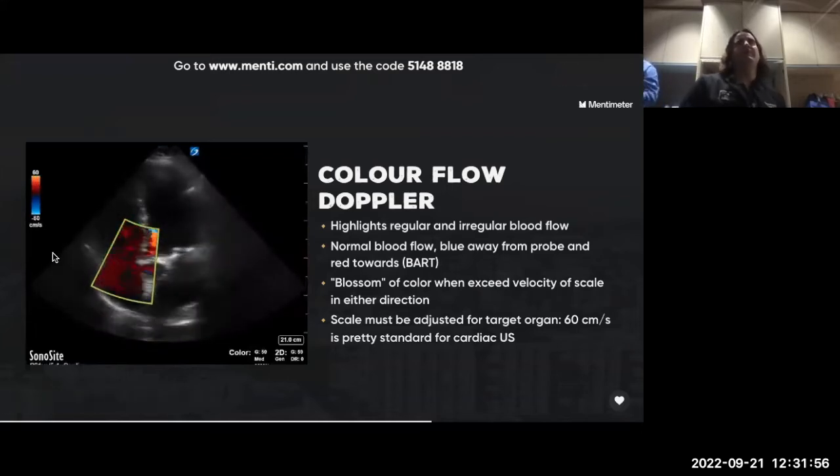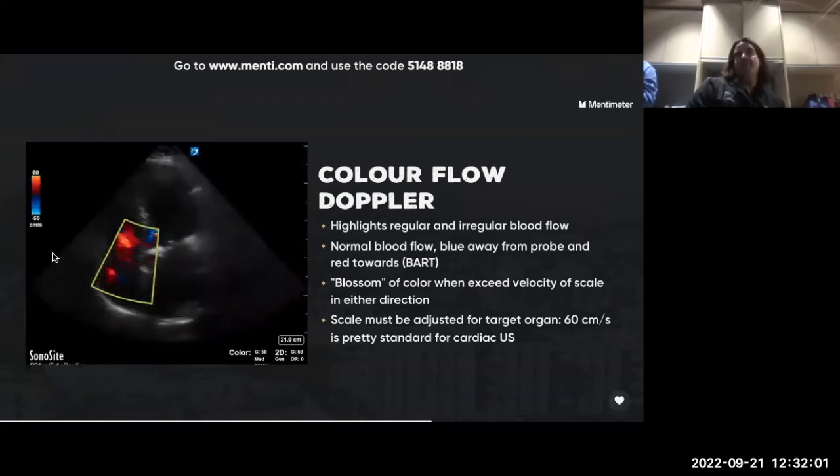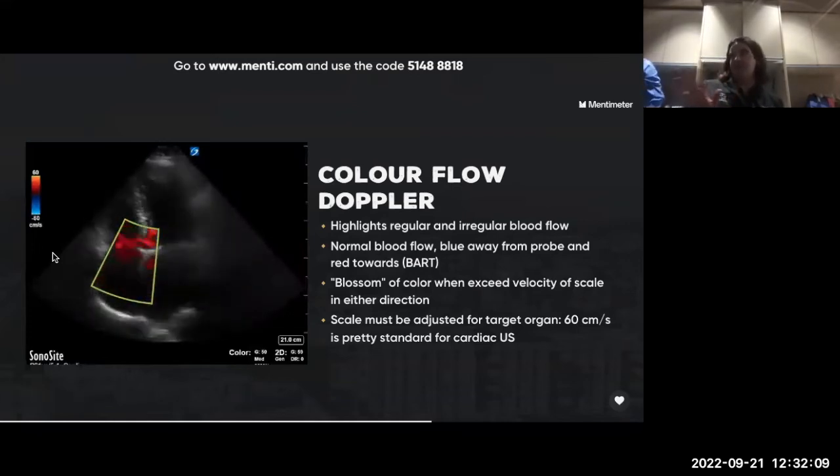Now a common example would be if you look at an iPhone or a video recorder recording a TV, and the frame rate is being mismatched, right?